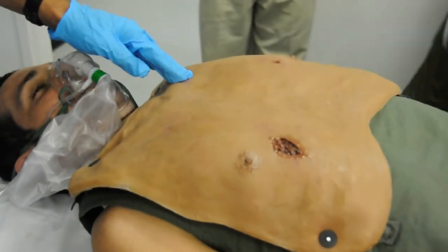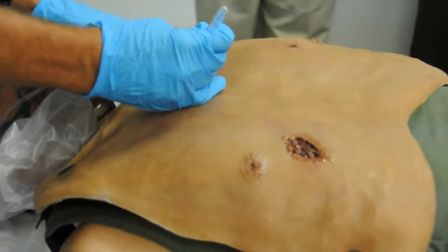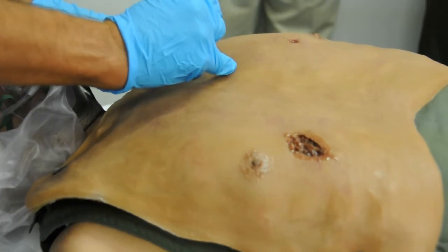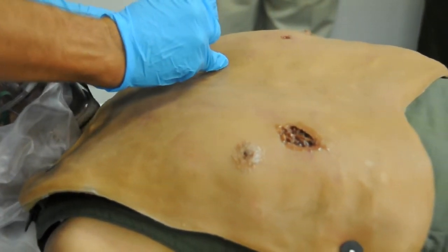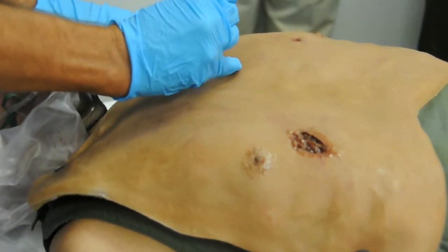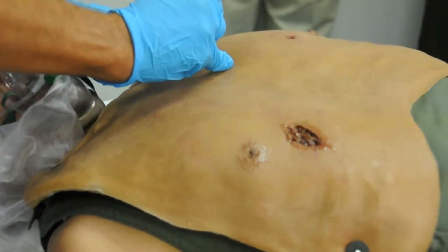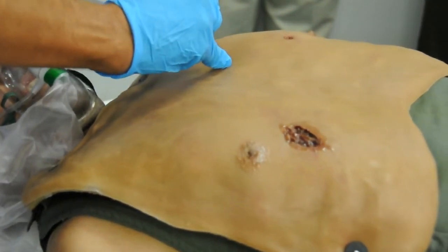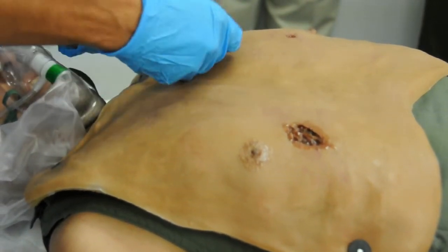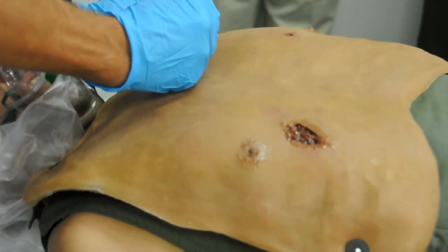Find the clavicle, mid-clavicular line, go to the second intercostal space. You're going to go just over the third rib, and you're going to go through, making sure you're just over the top of the rib, until you get a little pop through the skin. I walk myself over the top of that third rib, and you'll feel it give.